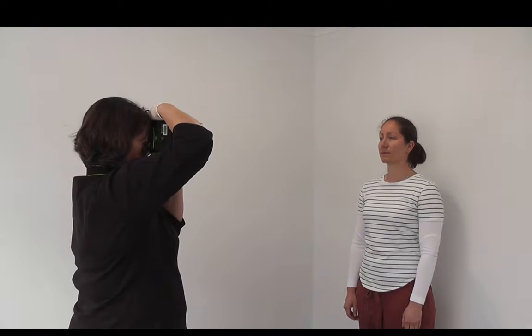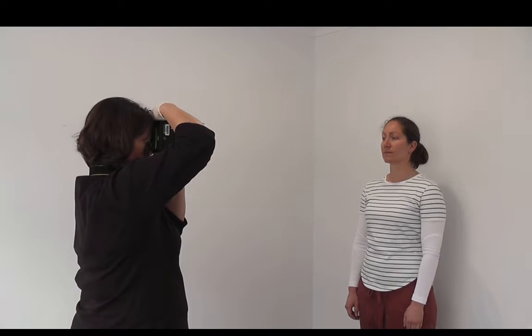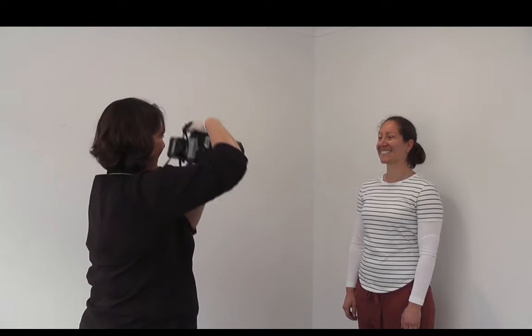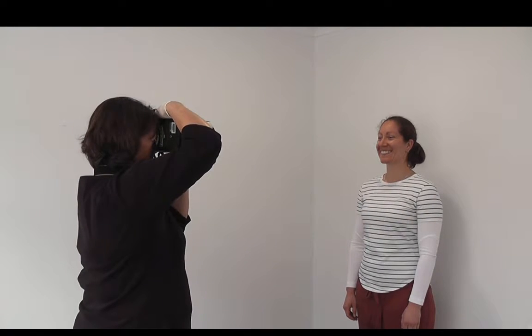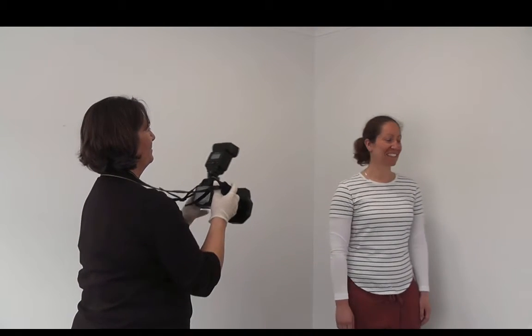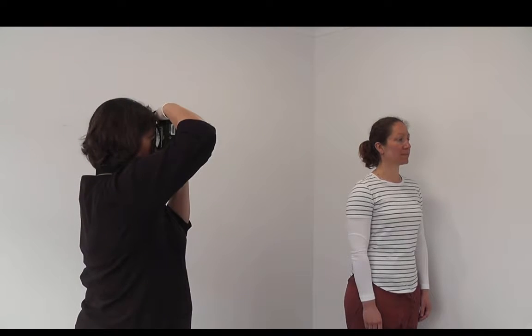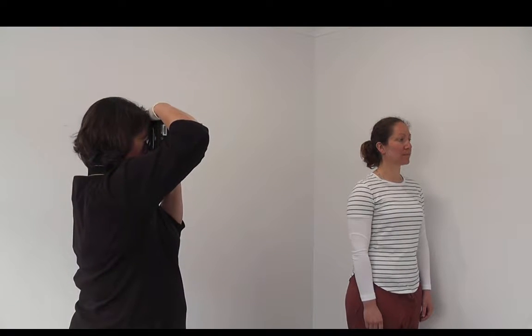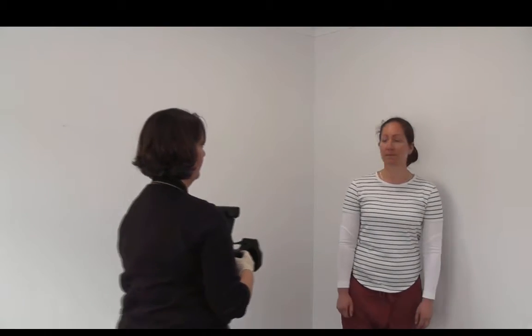The first three photos that you will take are the facial photos: the frontal photo taken at rest with no smile, the frontal photo with the patient smiling, and the profile photo at rest. The profile photo requires the patient to turn their whole body to the side, looking away from you at 90 degrees. Once this photo is taken, they can now stand facing you again.